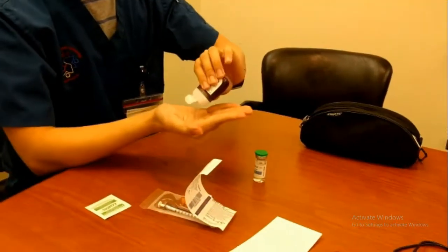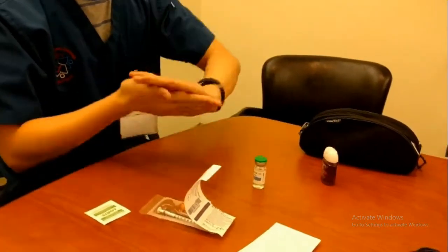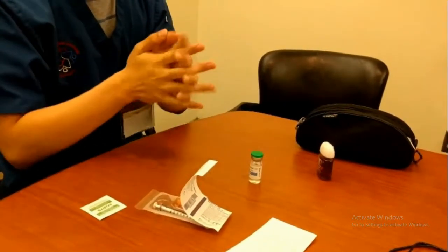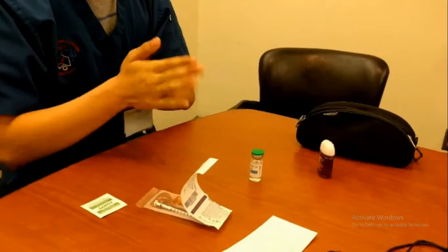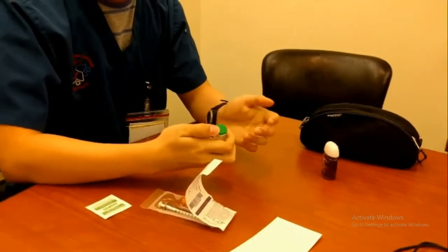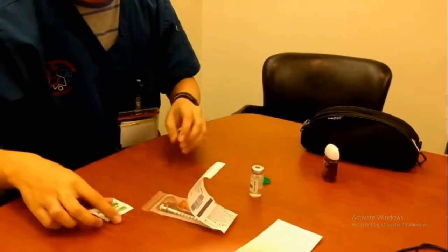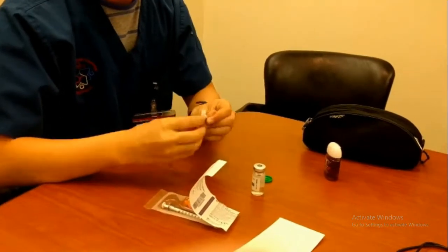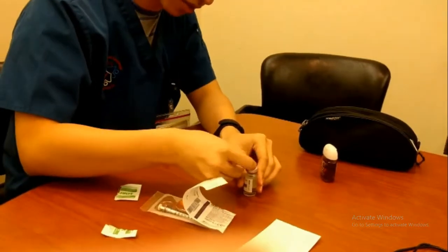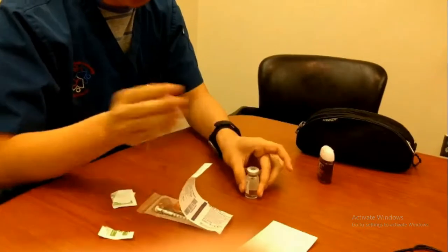Alright, so first I'll start by doing hand hygiene. In reality, I'll be using actual hand sanitizer in order to have effective hand hygiene. And so now I'm going to start by opening the vial safely. In reality, I've already opened it, but I would flick it off like this. Then I would open this alcohol swab, like so, and I would use the alcohol swab going from the inner to the outer, ensuring that it is clean.